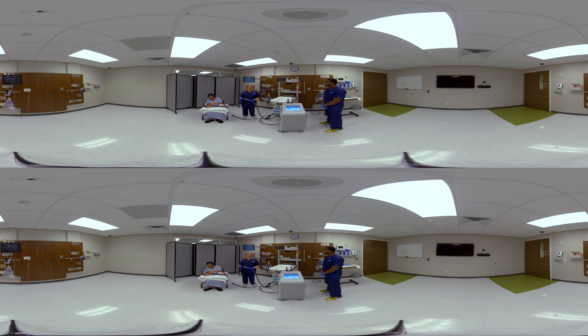During therapy, you'll want to ensure that you check the patient's skin according to your hospital protocol. You'll also want to make sure that the straps are not too tight across the patient's abdomen in order to allow for full respiratory excursion. If at any time you have alerts, alarms, or any questions throughout therapy, you can call the 866 number on your device.